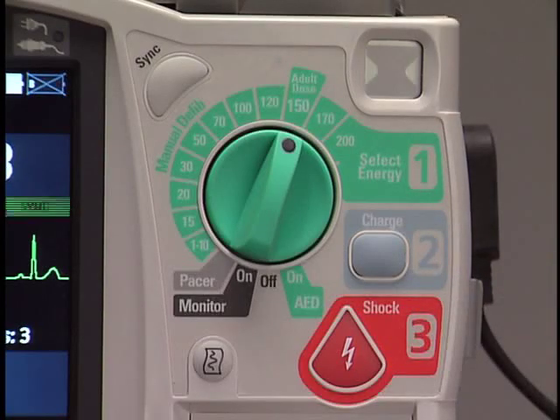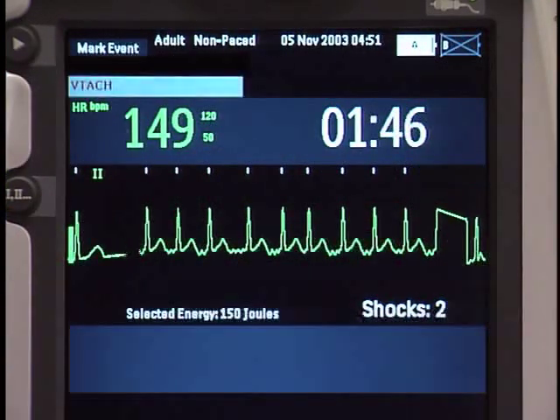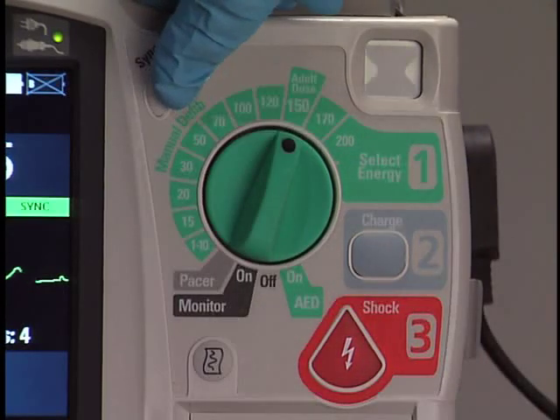You can deliver additional synchronized shocks simply by pressing the Charge and Shock buttons again. Disabling the Sync function is as easy as pressing the Sync button.